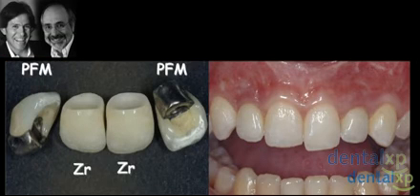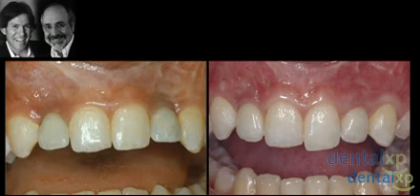Nice to focus on that, if you go back one moment, is you look at the tissue form vertically. If you were to put this in black and white, there's not a huge difference left and right. This is really a buccolingual and color issue. So you're looking at volume. You add volume of tissue here, which is kind of hard to see in two dimensions, and you've obviously dramatically changed the color. And then, of course, that shadowing, which we don't really see in slides.